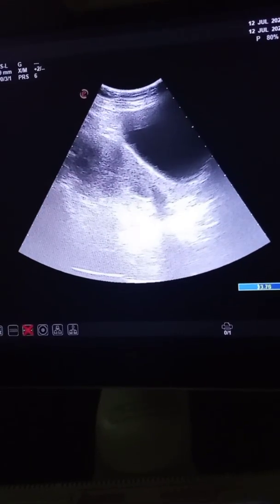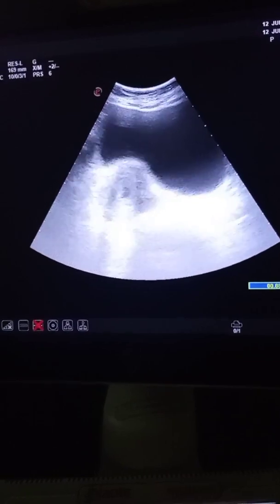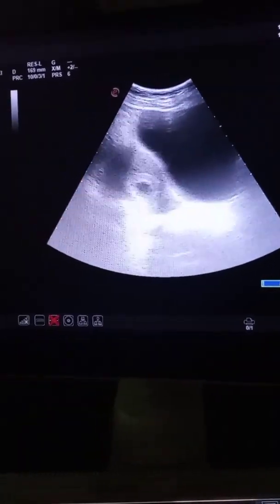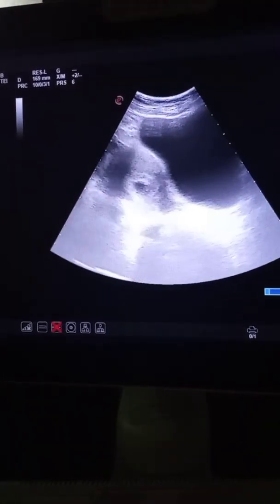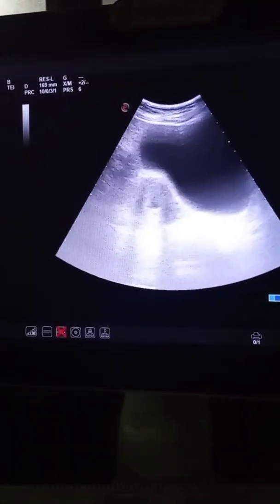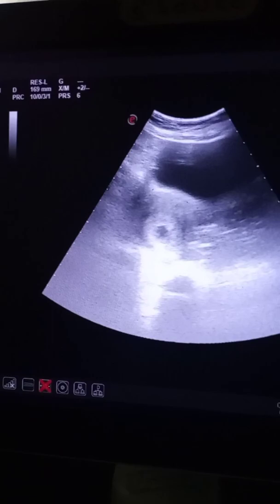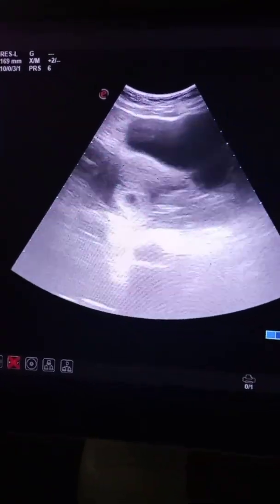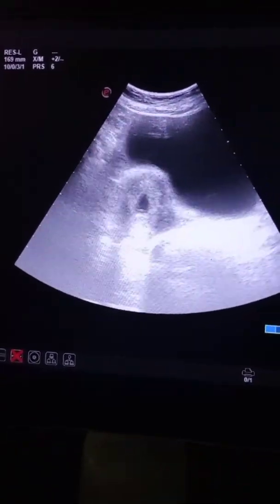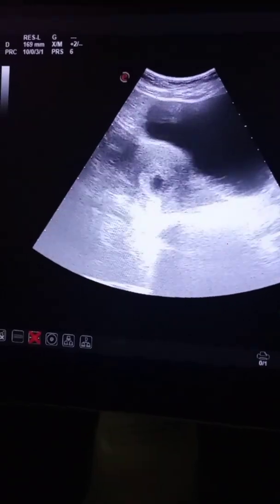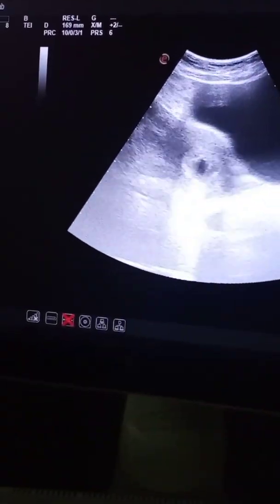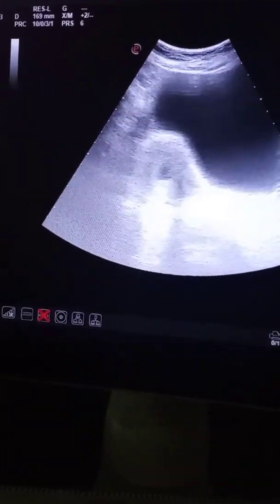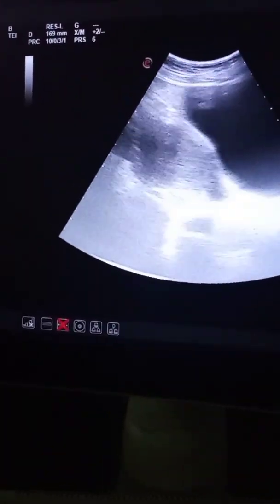Hello and welcome to another interesting video of my YouTube channel. This patient presented to me with lower abdominal pain and pervaginal bleeding for the past two days. Ultrasound shows a retroverted uterus, and there is a gestational sac of 15mm in the lower uterine segment without any fetal pole or yolk sac.